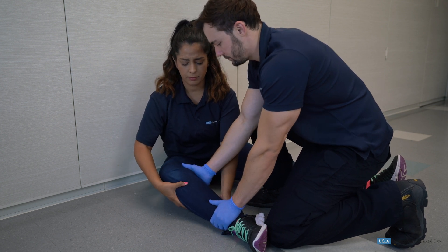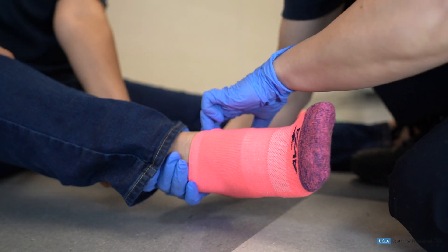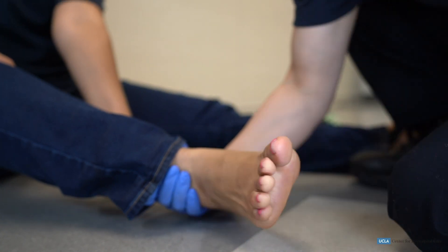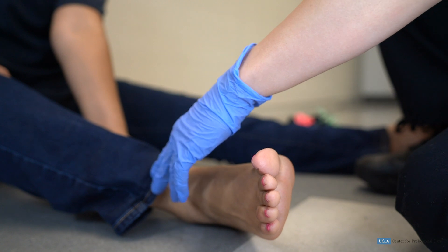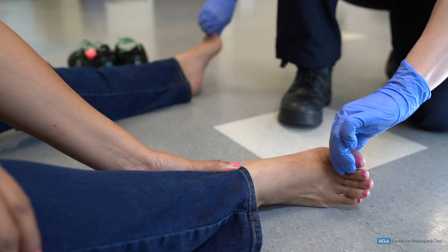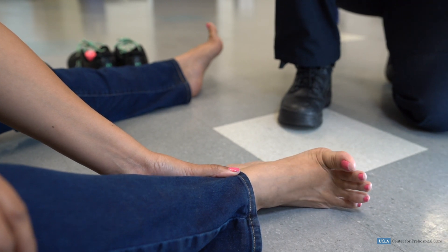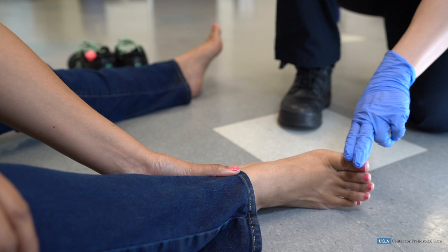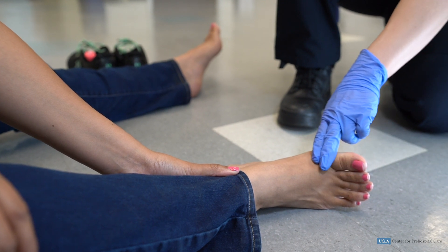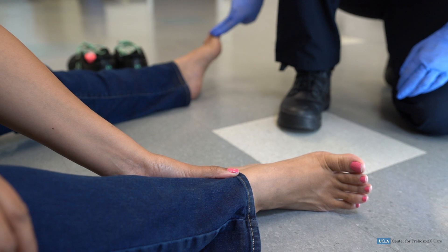While the EMT assesses for circulation, motor function, and sensation distal to the injury. Circulation can be assessed by palpating a distal pulse or capillary refill time. Motor function can be assessed by having the patient move his or her fingers or toes on the injured extremity. Sensation can be assessed by touching a finger or toe distal to the injury and asking the patient which digit the EMT is touching.